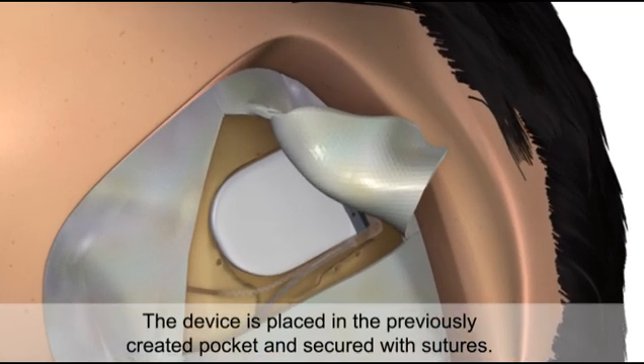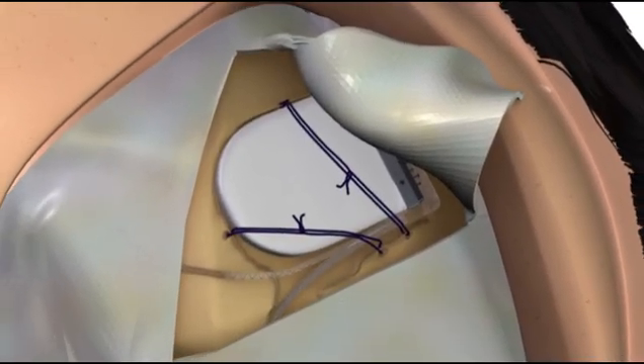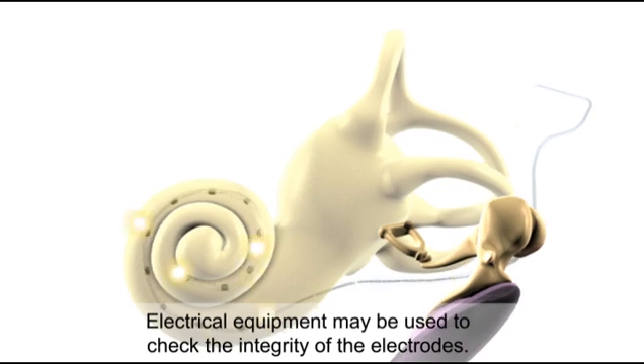The device is placed in the previously created pocket and secured with sutures. Electrical equipment may be used to check the integrity of the electrodes.